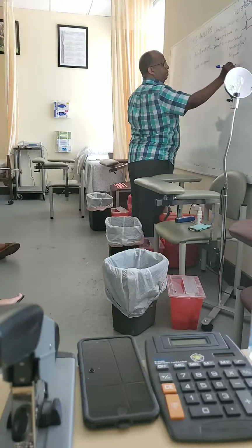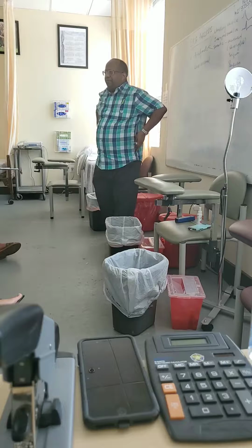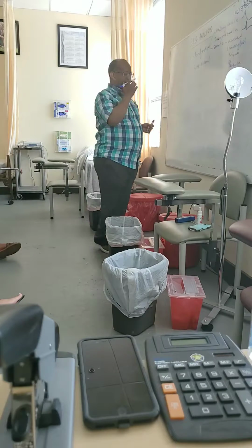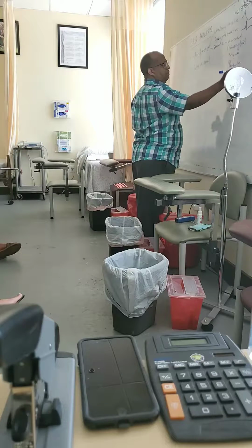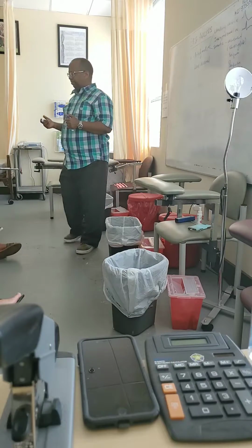In the case of Parkinson's, you have to tell the patient to hold the hands so that it will be stable. Another one is respiration or breathing. Sometimes fast and irregular breathing can lead to somatic artifacts.